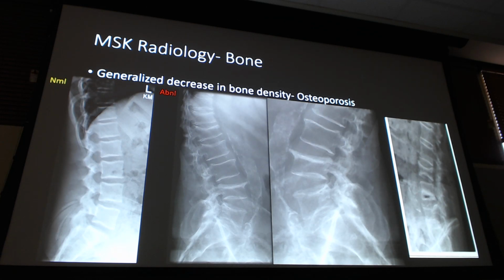So sclerotic areas of bone are more radiopaque than normal bones. Okay? Which means if you wanted to compare the two, a healthy bone would be more radiolucent than a sclerotic area of bone. Does that make sense? Okay. So remember, radiopaque and radiolucent are describing how bright they are, how dense one is compared to the other, but sclerosis is an actual metabolic process that's happening due to the avascular necrosis.